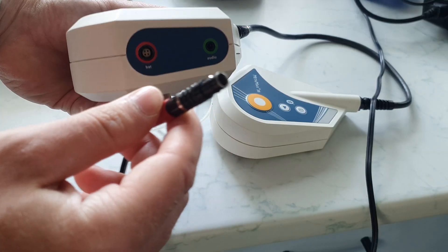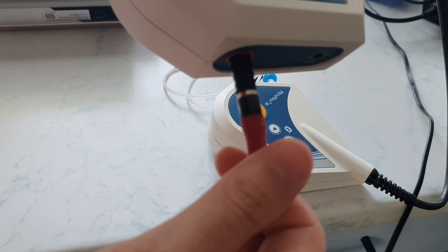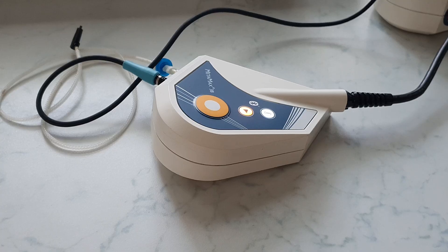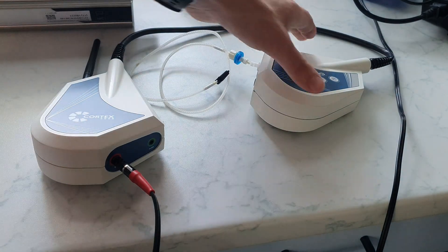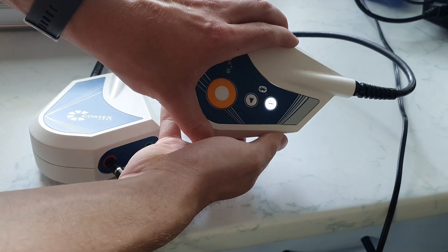The power cable is connected here, red dot to red dot. Before the unit is switched on, it is essential to connect the gas sensor hose, otherwise it would draw unfiltered air. When connecting the gas sensor, make sure that it is locked with a slight clockwise rotation; this should not be done with too much force.